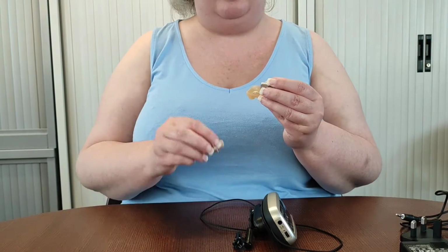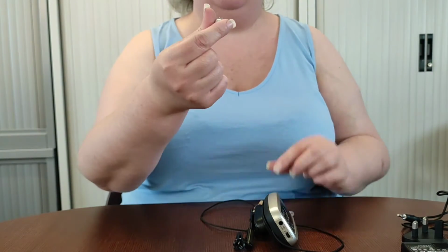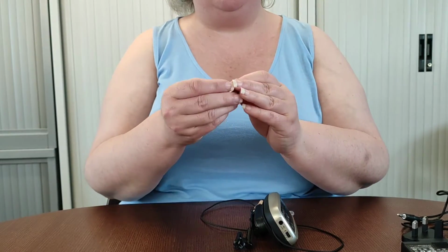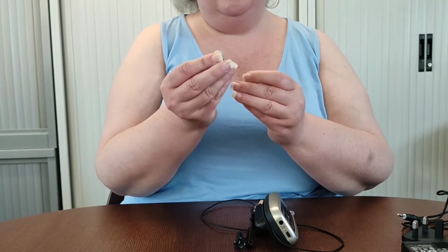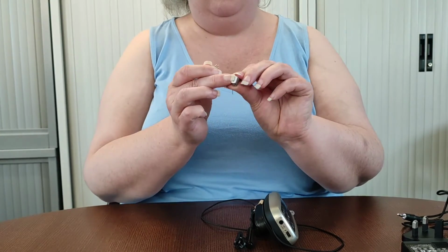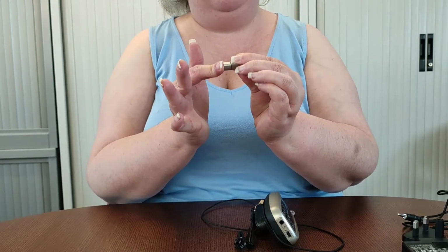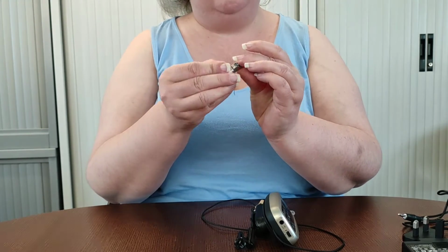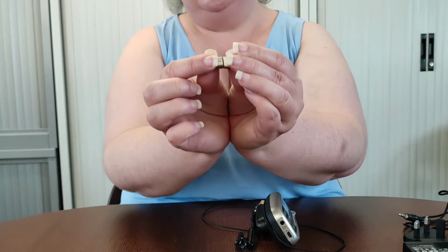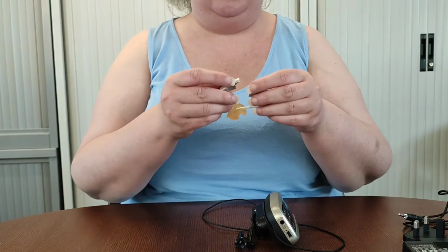And then we also have this receiver which has 3 prongs, and you might notice that on the bottom of the audio shoe there are 3 holes. They are differing in size because the prongs are different in size, so we want to make sure we match up the larger width prong with the larger hole on the audio shoe. So when we attach them, we need to hear a clip, and we need to make sure that we can see that it's sitting flush with each other and there isn't a gap. If there's a gap, it's not going to connect. So we do need to make sure it is connected flush with the other part of the device.